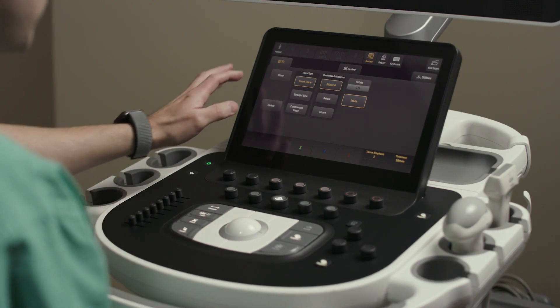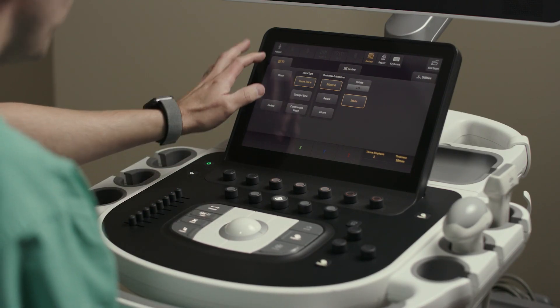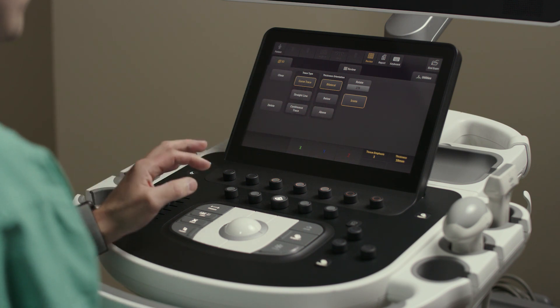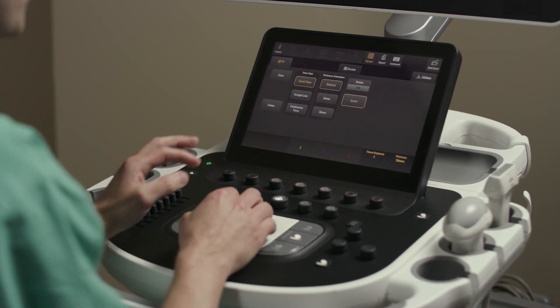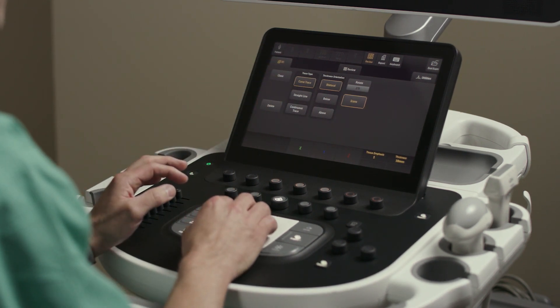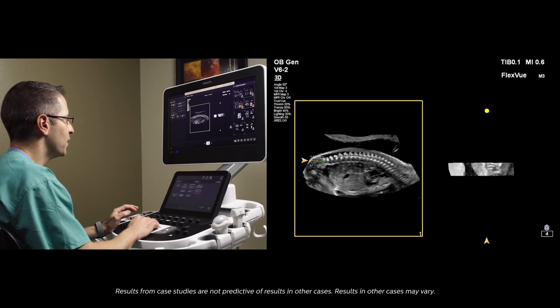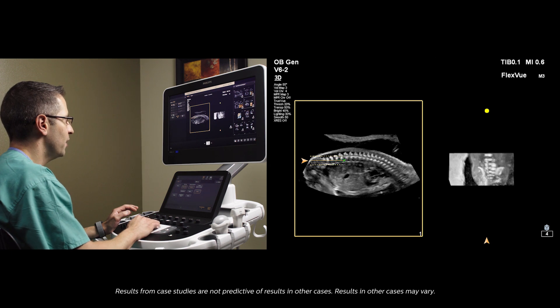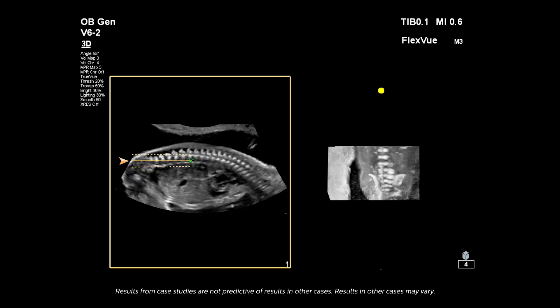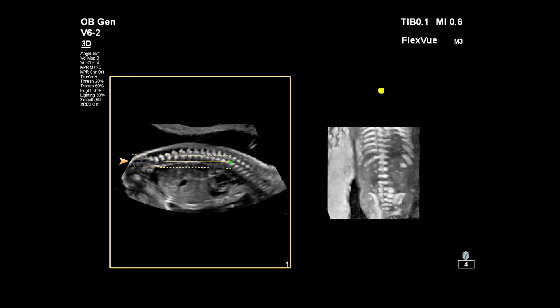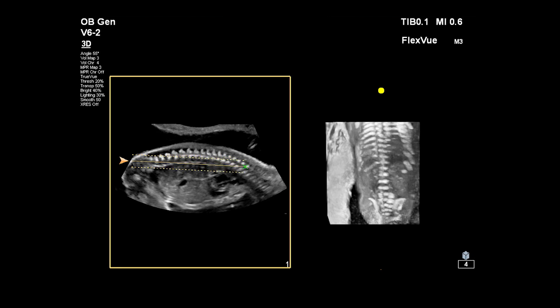Now with FlexView selected under the 3D tab, I'm going to use Curve Trace because the fetal spine is curved. I'll place this initial reference point and slide through — you're going to see the sacrum come into focus, the vertebral bodies coming into focus, and the ribs.